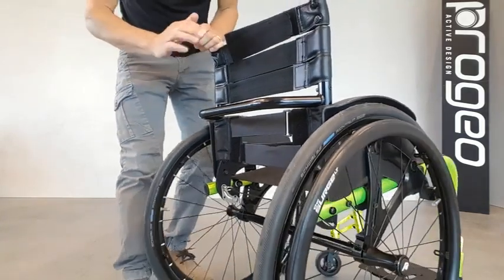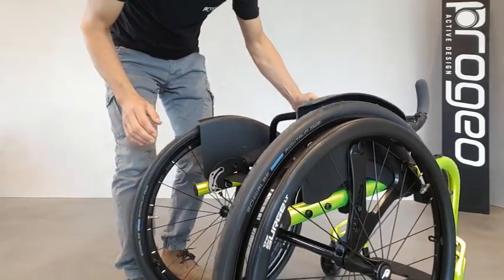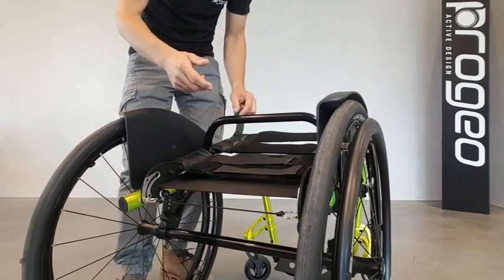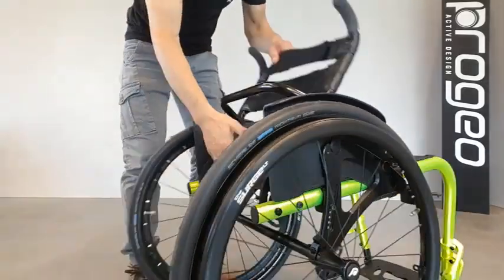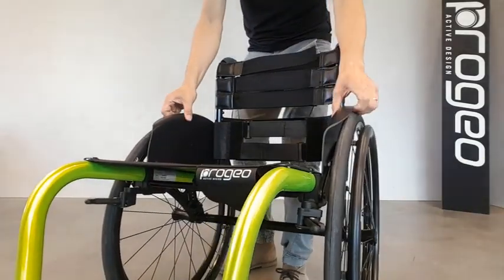The Velcro straps are adjustable. The backrest is also folding, and when you fold it, it locks in its folded position — meaning you can even lift the wheelchair by grabbing it by its rigidizer. Another standard component is the mudguards or side guards, which are removable.